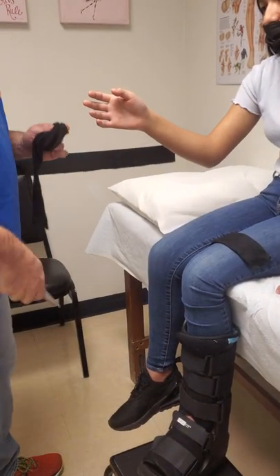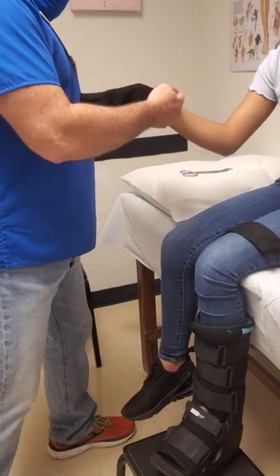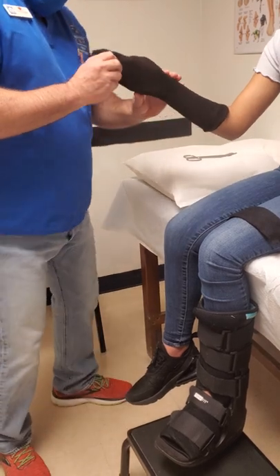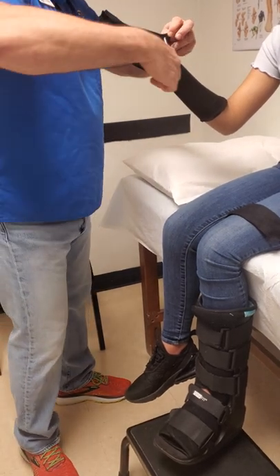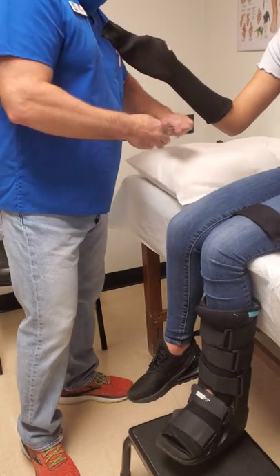The first thing you need to do is place the stockinette on the arm. You're going to slide all the fingers including the thumb in. For right now just focus on keeping her wrist nice and straight, fingers nice and straight. Make a little hole so that her thumb can come out at the base of the thumb, like we did in the previous video with the short arm cast.